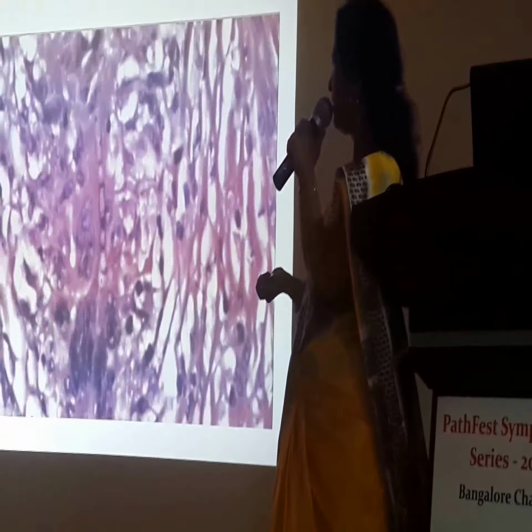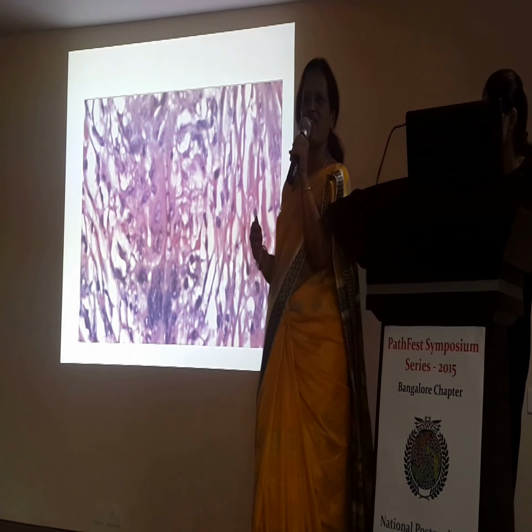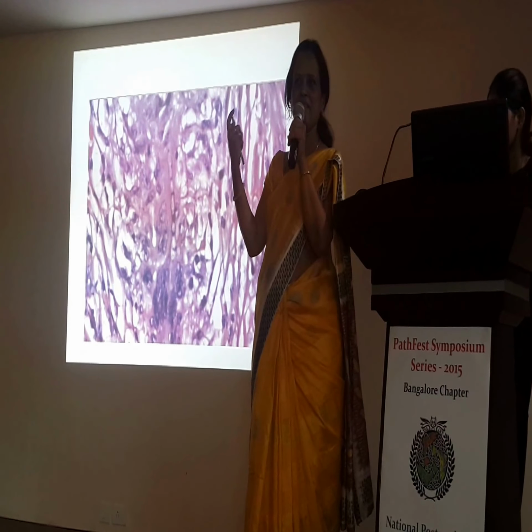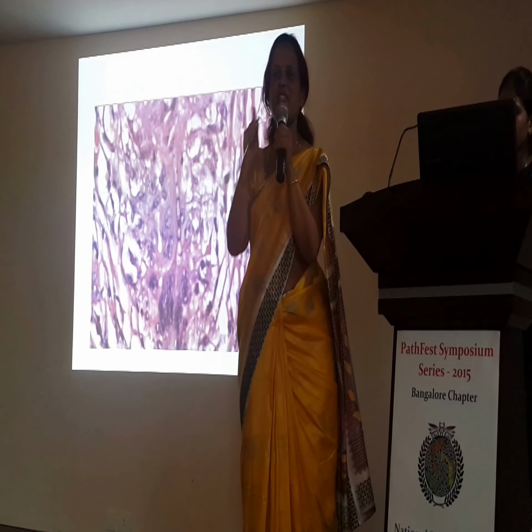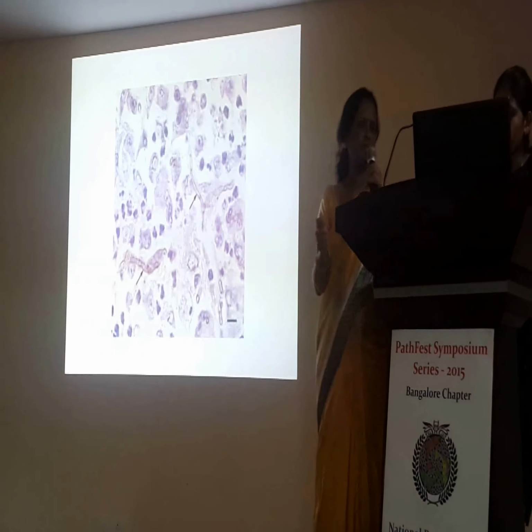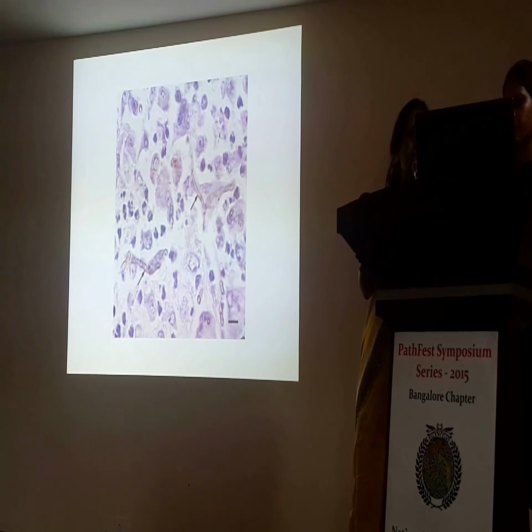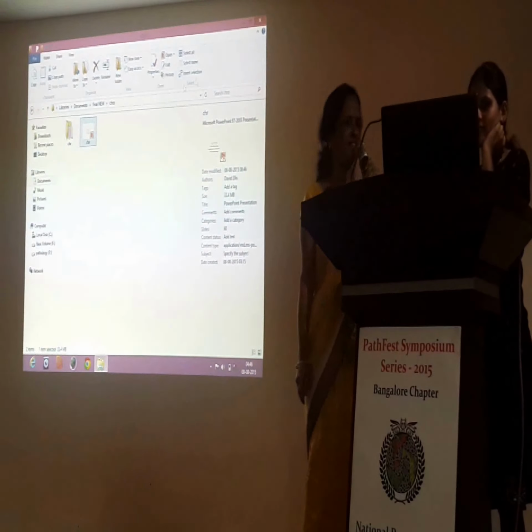Next. Yeah. This is just to show you that case Dr. Jairam had sent. So these are the fungal pseudohyphae which are engulfed. Such big ones. If you have this take-home message, that yes, I need to look for this, then you will never miss anything. Yes. We'll go on to the next case. You don't know what the next case is, but I'm not just numbering cases.